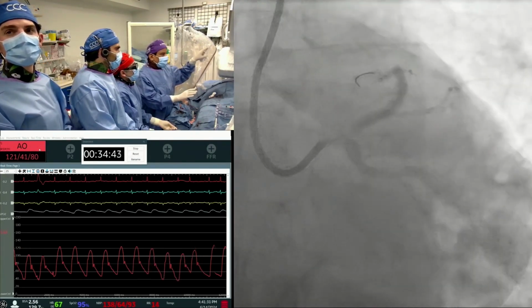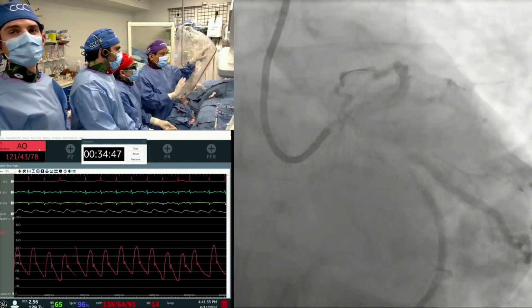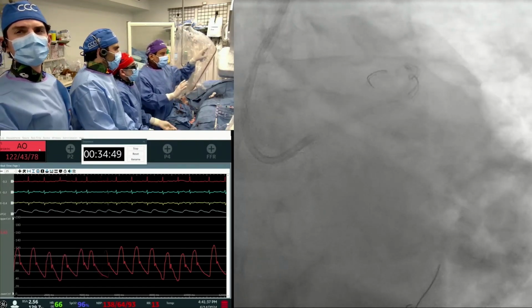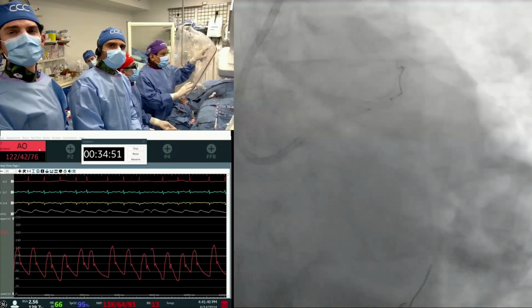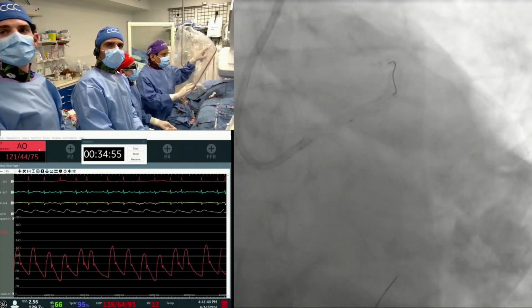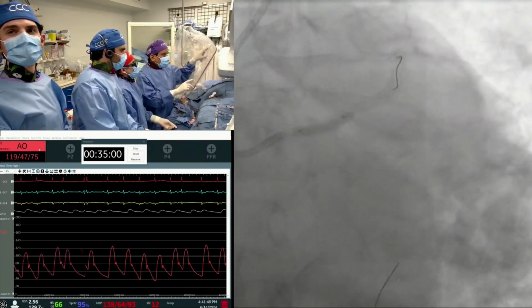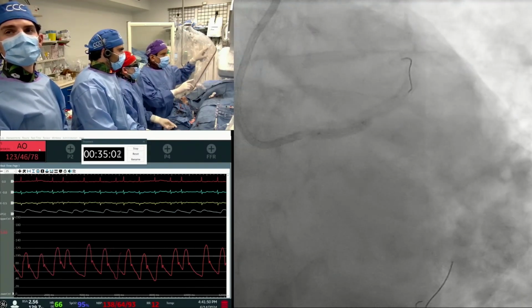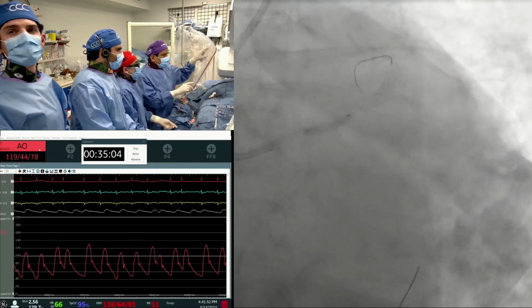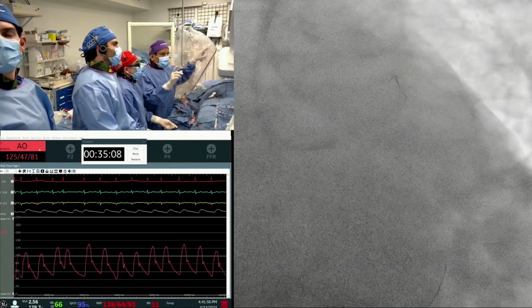Now, what RPM did you have to go? 150. It went through at 150. We just increased it, and we did the balloon dilatation. As you can see here, that too has to be done on the cine. This is the 3.5 balloon? Yeah, 3.5, 12 millimeter. We went to 16 atmospheres, post-dilated with a high-pressure balloon, and then we did the IVUS.